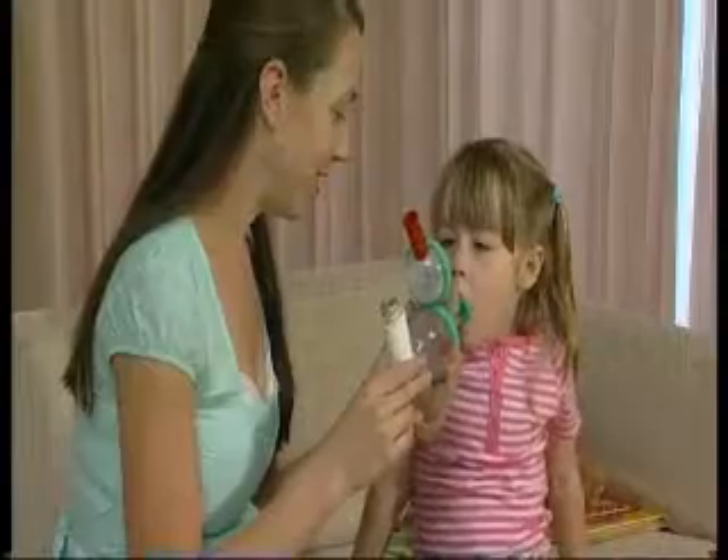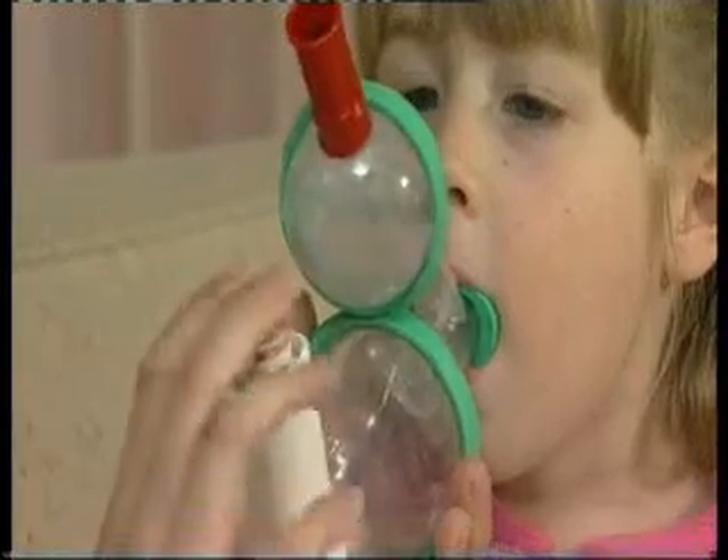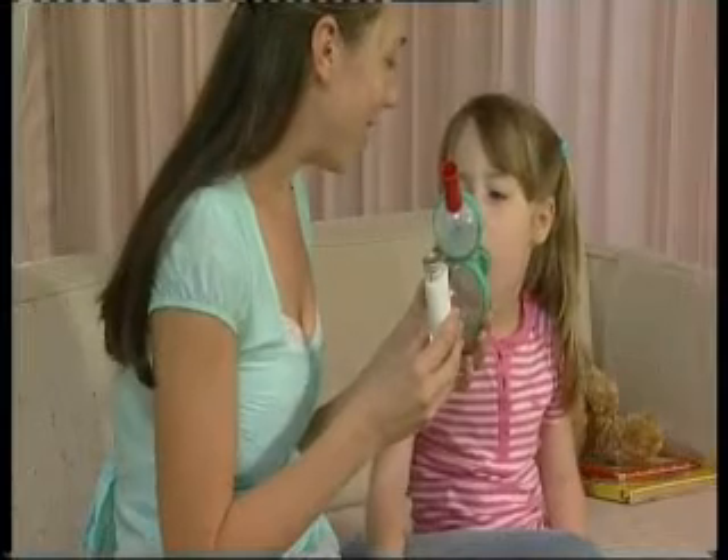Insert the Funhaler mouthpiece into your child's mouth. When your child is breathing through the Funhaler, press the puffer once to dispense one dose. Your child should take four to five deep breaths to empty the chamber.